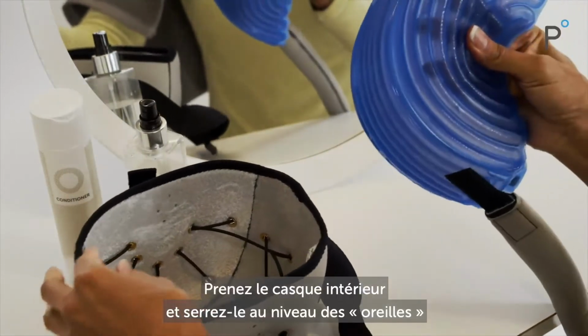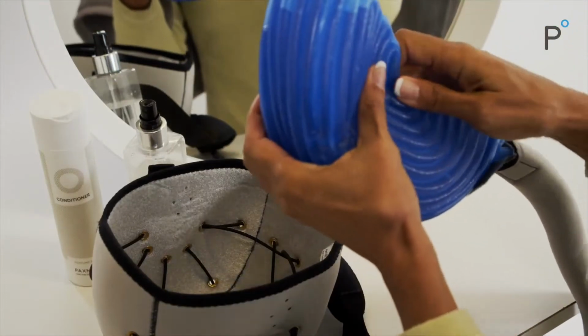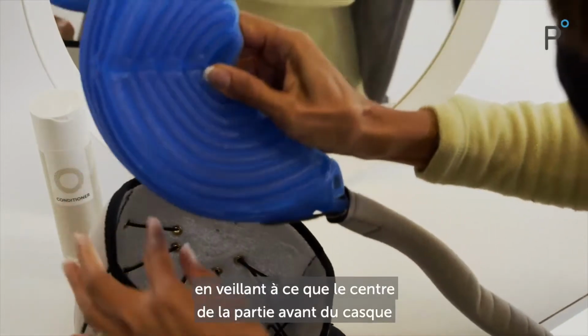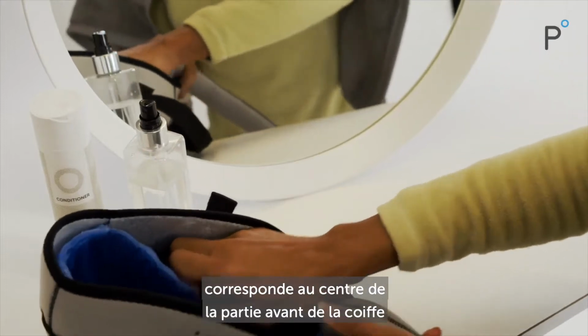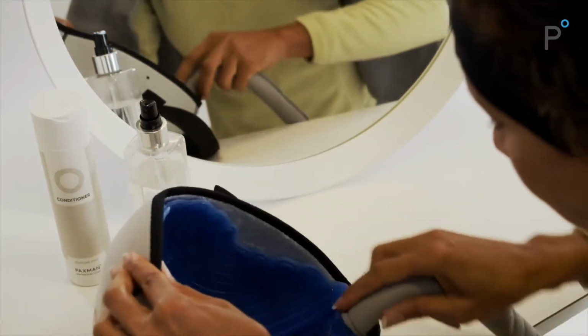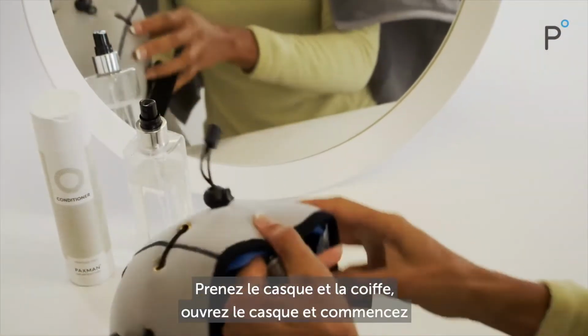Take the inner cap and squeeze it together at the ears to identify the center. Place the inner cap inside the cover, ensuring that the center point of the front of the cap matches with the center front of the cap cover, and the tubing at the back of the inner cap lines up with the labels at the back of the cap cover. Pick up the cap and cover.